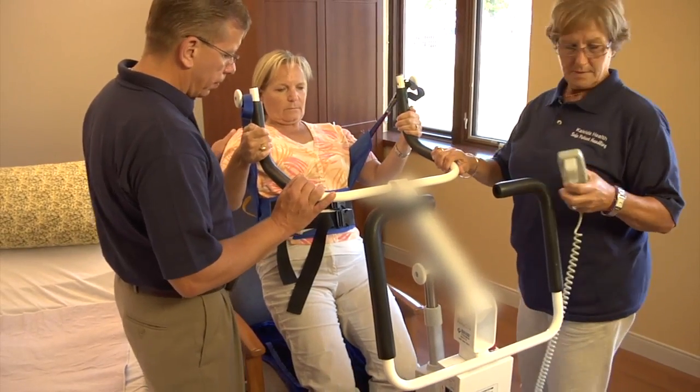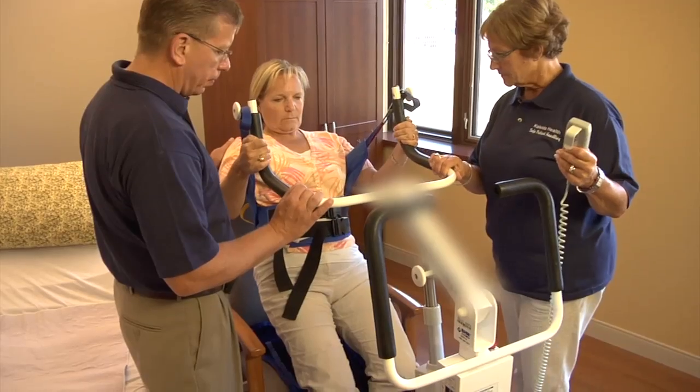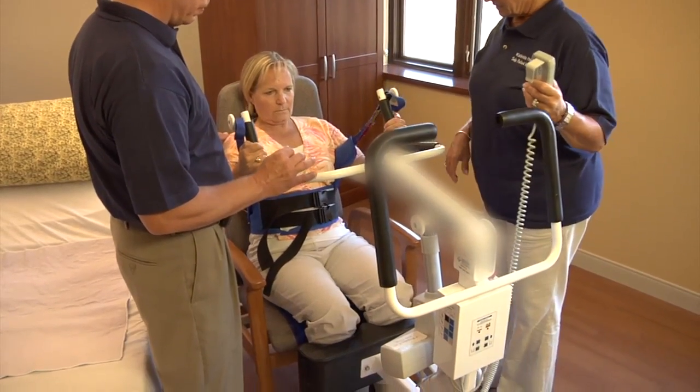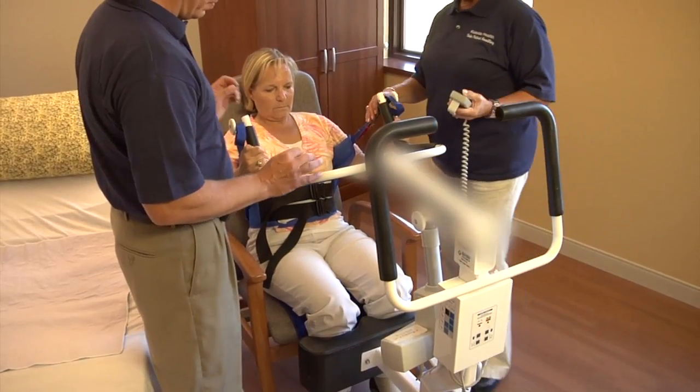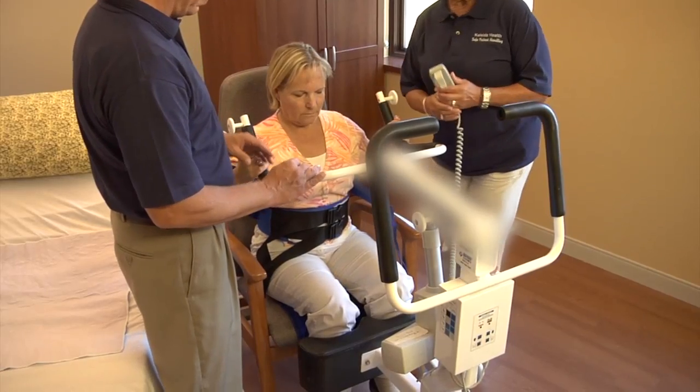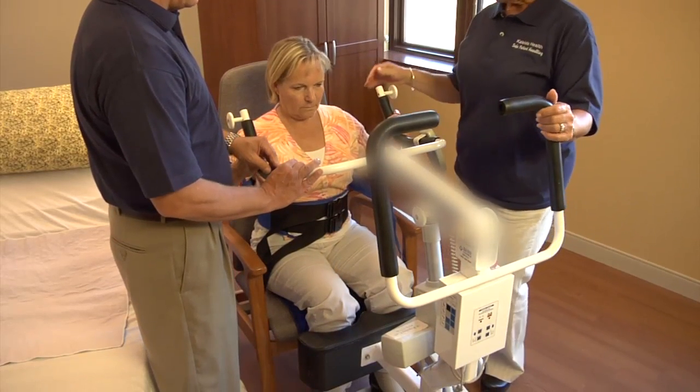Another safe patient handling tip could be that you can take your sit-stand lift, stand your patient up just high enough to put a sling under them. Once you have the sling under them, you can detach them from the sit-stand lift and then transfer them with the full mechanical lift if that's what's needed.